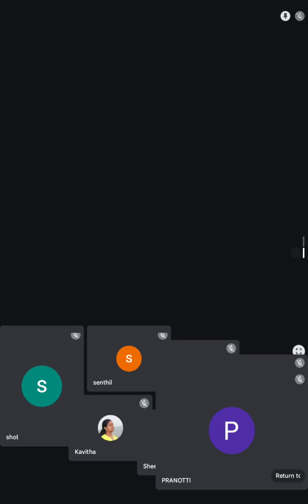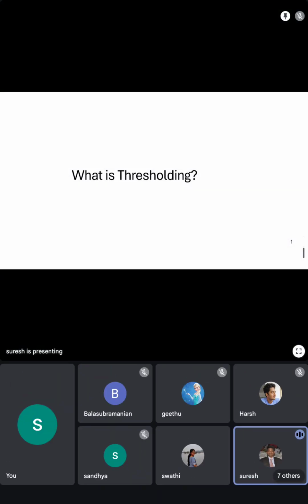So what is thresholding? Madam just now explained. Can you tell me what is thresholding? It is the ability to detect a minimum stimulus, sir. Ability to detect a stimulus is okay, but what are we trying to see? The minimum intensity. The dimmest point the patient can see.